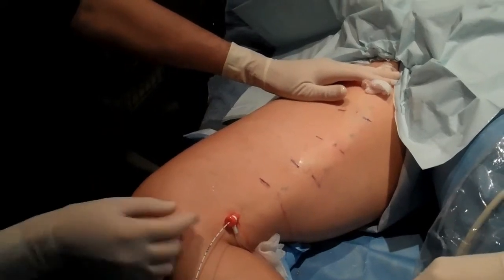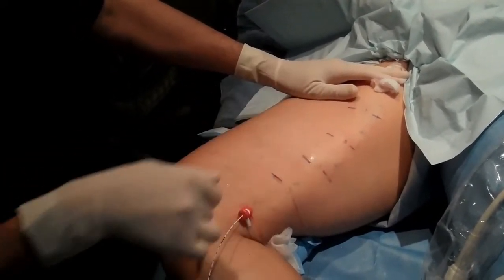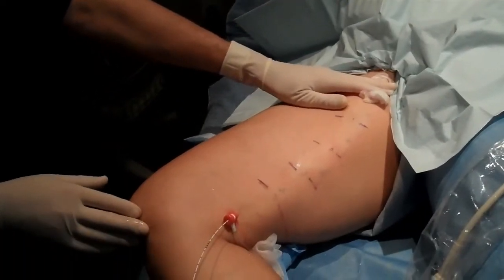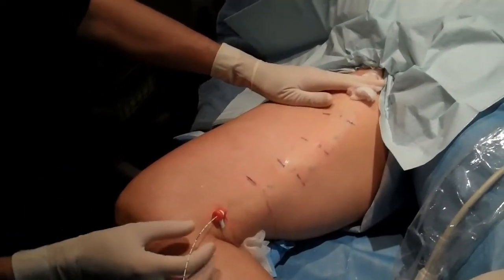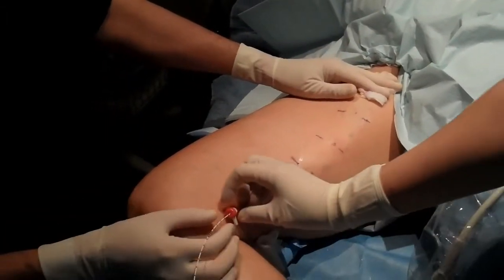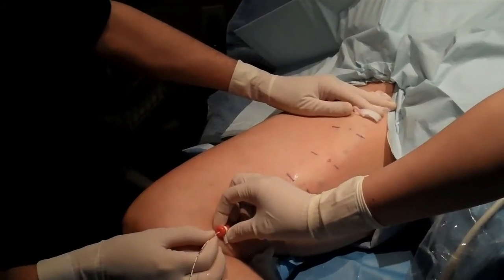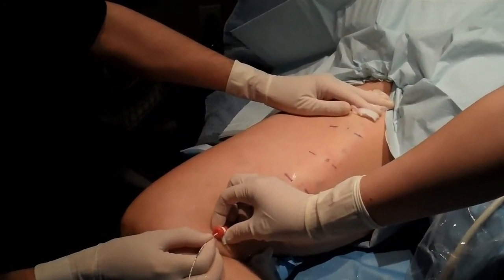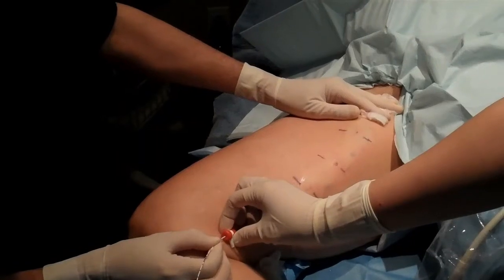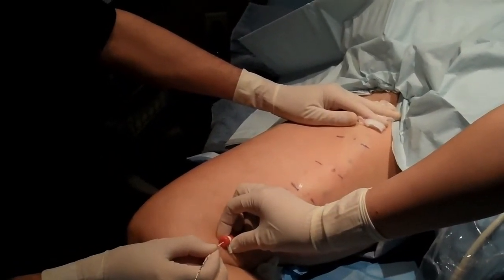We will very slowly pull out this catheter, which will take about four minutes. It will then close the vein instantly. I'll start the pullout — hold here please. It takes 10 seconds to pull out one centimeter.